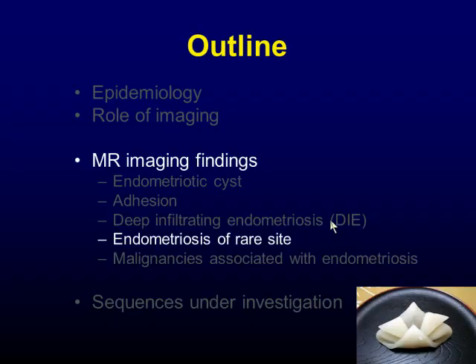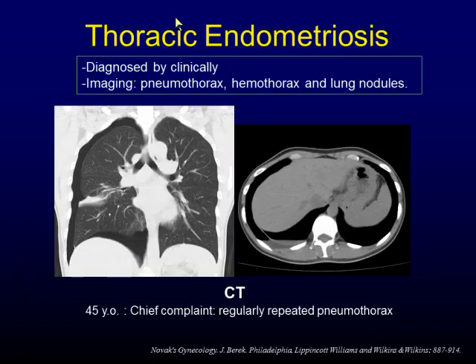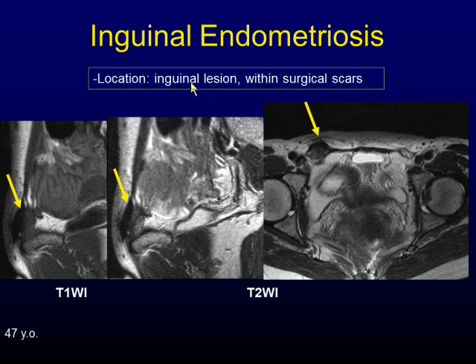I will show a few cases of rare sites of endometriosis. Thoracic endometriosis is uncommon and is usually diagnosed clinically. Most imaging findings are pneumothorax, hemothorax, and lung nodules. This patient complained of regularly repeated pneumothorax. At operation, a small defect was found on the diaphragm, suggesting migration of endometrial tissue from the peritoneal cavity to the pleural cavity. Endometriosis can also occur in cutaneous tissue, such as the inguinal region or within surgical scars, usually after prior gynecological operation. At MRI, the inguinal region shows low signal intensity on both T1 and T2-weighted image due to fibrosis.